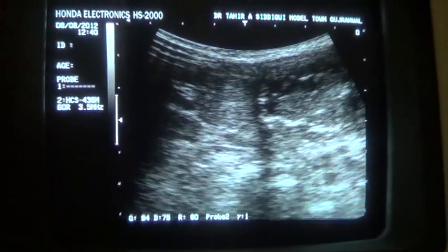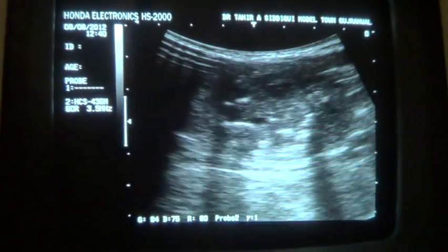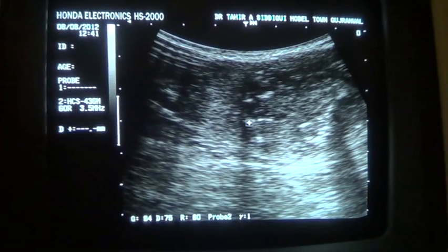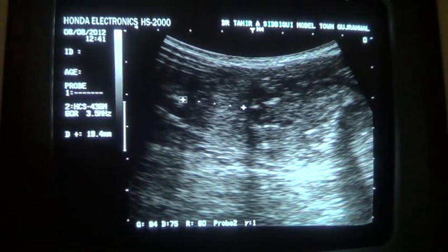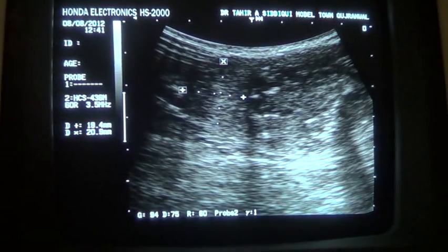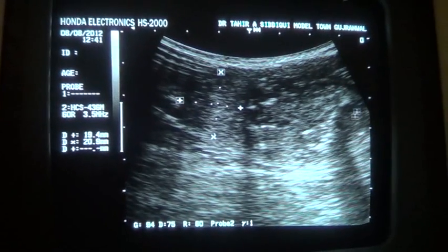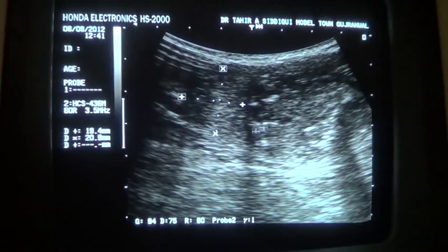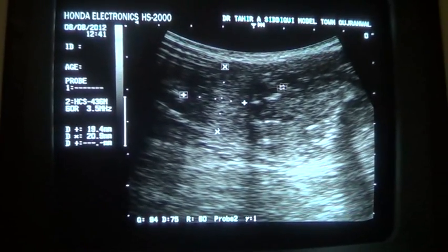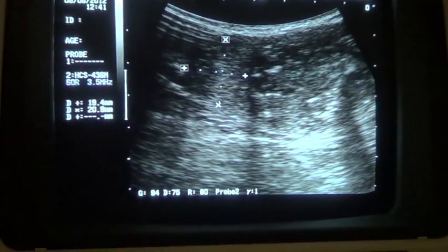Now this is the preserved thyroid gland. The lateral 1/3 of the gland is preserved. This area of the right thyroid gland is preserved as normal low-level coarse echogenicity, and this is the focal mass, echogenic with internal calcifications. These are all calcifications, marginal, shadowing and non-shadowing both.